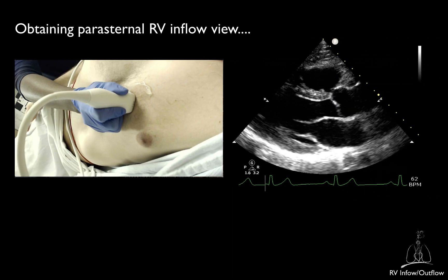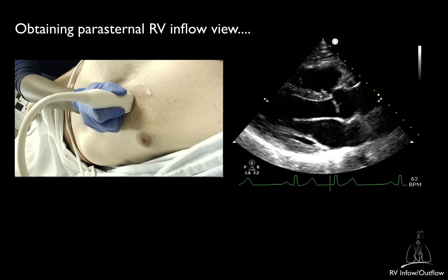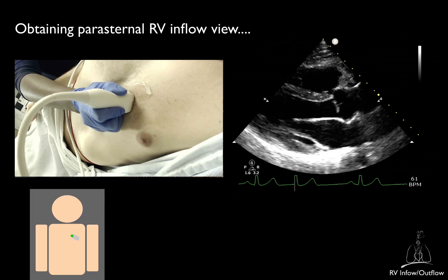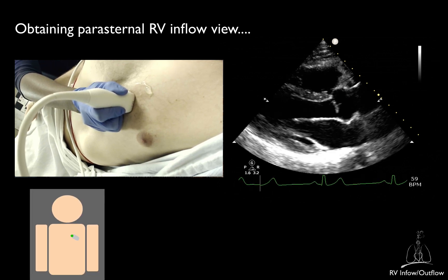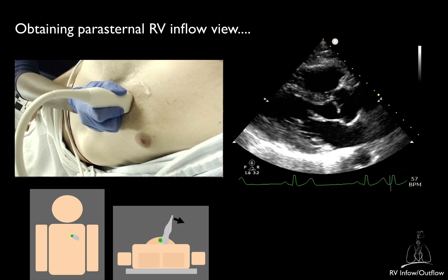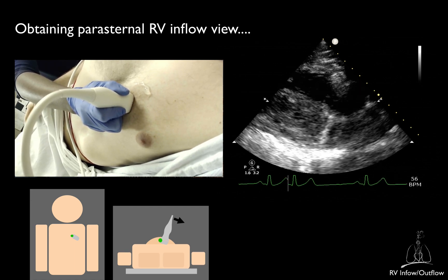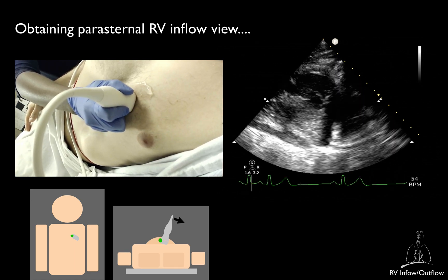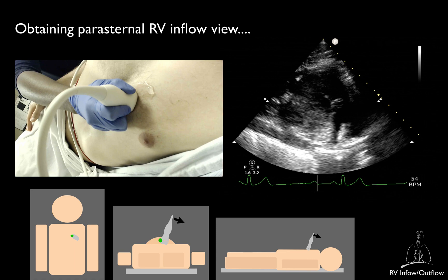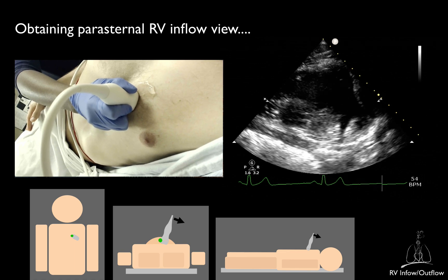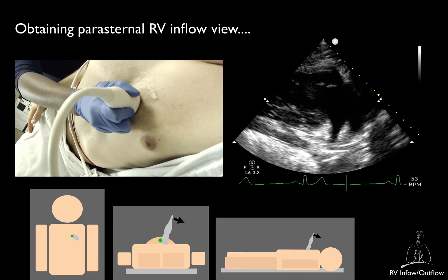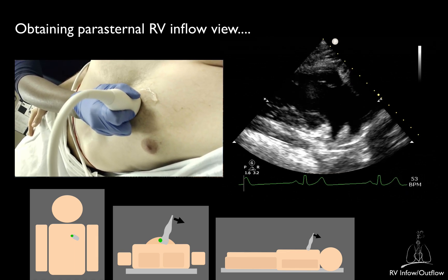To obtain a parasternal right ventricular inflow view, from the parasternal long axis view, tilt the transducer tail toward the left shoulder — that is, direct the ultrasound beam downward and medially. By doing this movement, you will see the tricuspid valve coming into view.